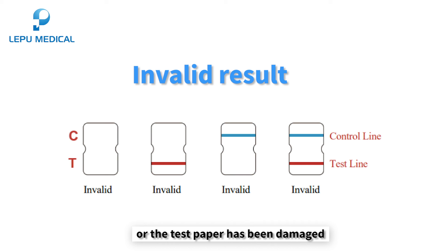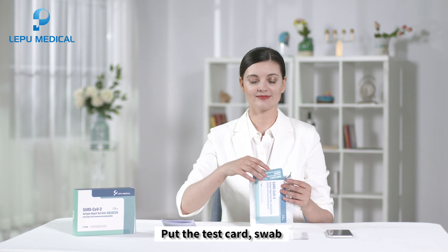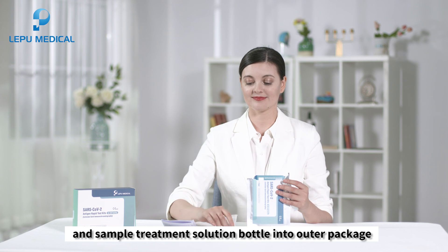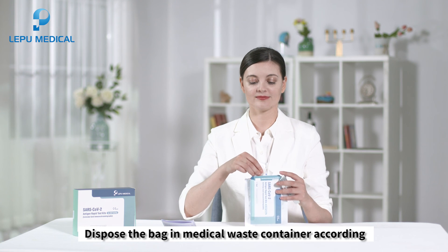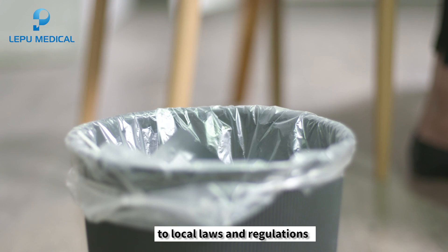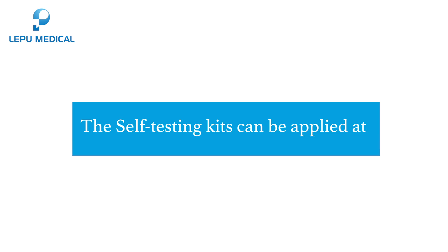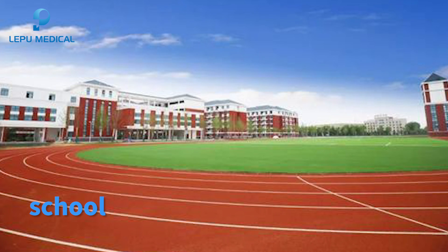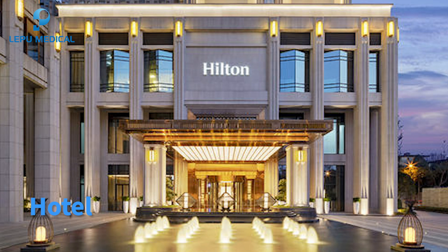After the test, put the test card, swab, and sample treatment solution bottle into the outer package and seal it tightly. Dispose of the bag in a medical waste container according to local laws and regulations. The self-testing kits can be applied at home, school, office, corporation, airport, or hotel.